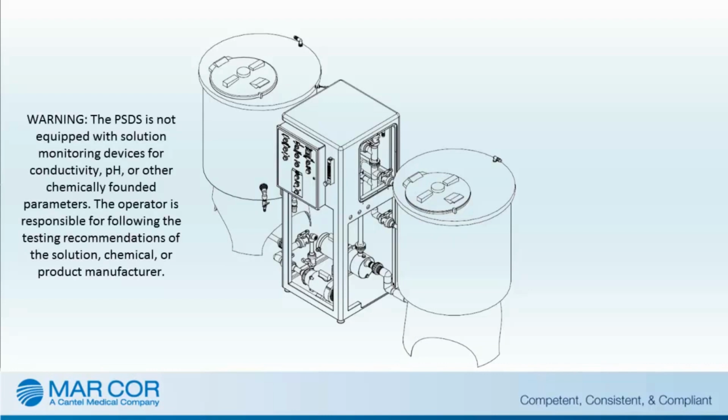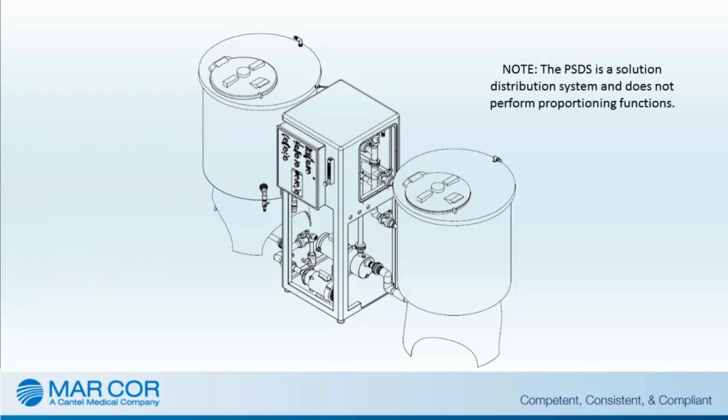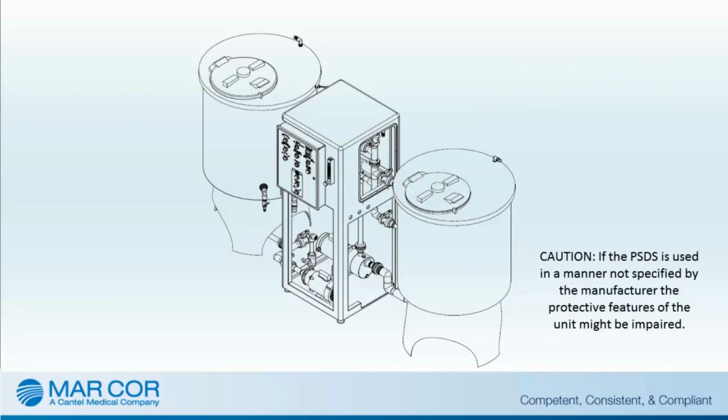Warning: the PSDS is not equipped with solution monitoring devices for conductivity, pH, or other chemically founded parameters. The operator is responsible for following the testing recommendations of the solution, chemical, or product manufacturer. Note: the PSDS is a solution distribution system and does not perform proportioning functions. Caution: if the PSDS is used in a manner not specified by the manufacturer, the protective features of the unit might be impaired.